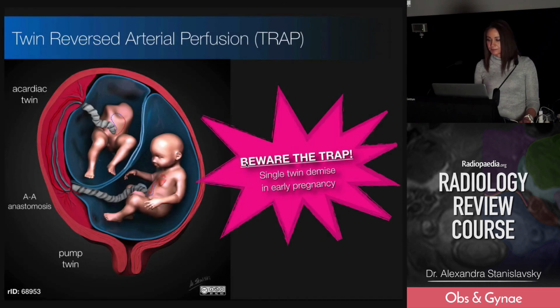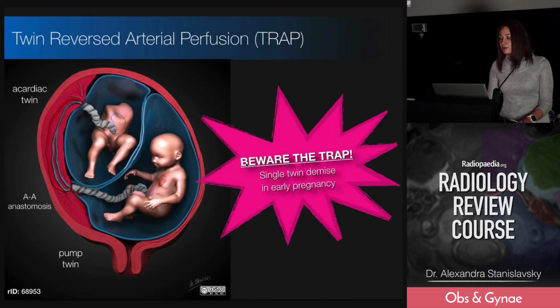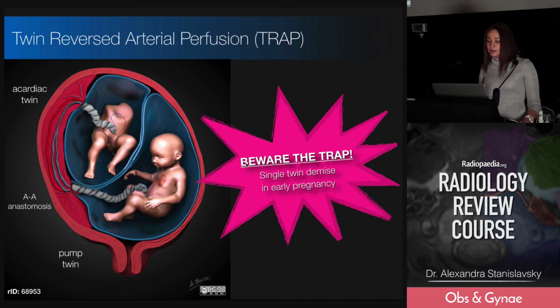It's reversed. And just one final word of caution. Beware the trap, okay? Beware the situation where you've got a single fetal demise early in pregnancy and the baby's not getting smaller, so it's not in the process of vanishing, so to speak. It actually stays the same or gets bigger, okay? You have to look really carefully for the vascular interconnections and pick this up, because of course this presents a risk to the surviving twin.